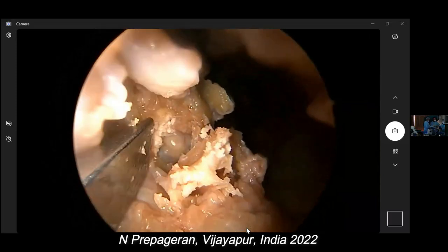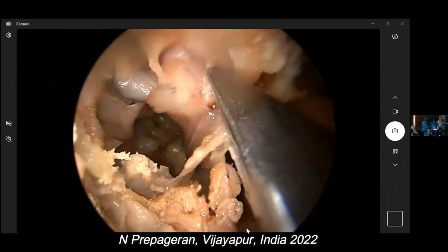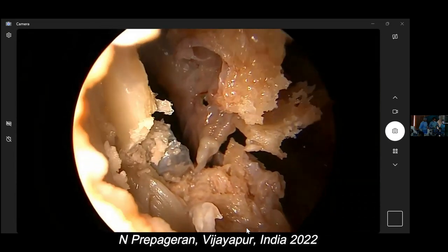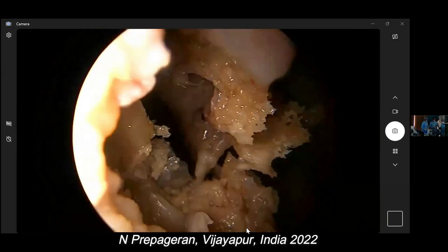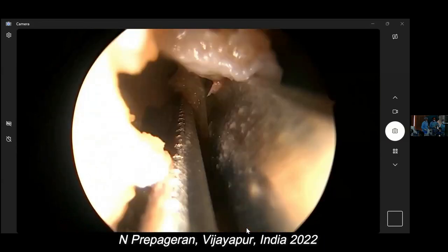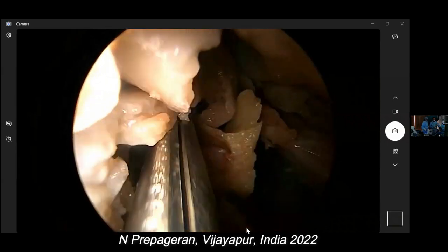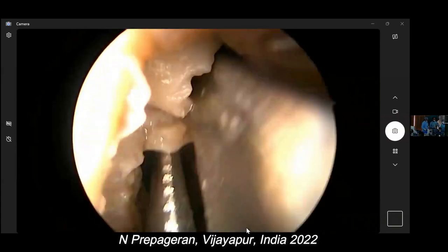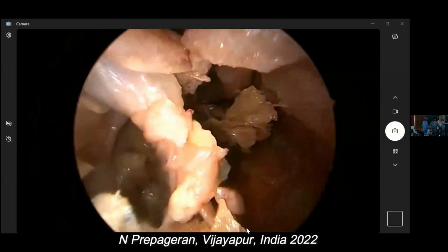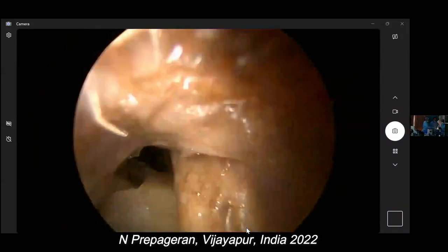There, I'm in now. Okay. There. This is now Denker's procedure. So how do we take care of this lacrimal duct during Denker's? Yeah, I'll show you. I'm just about to show you. Patience, my child, patience. But I like your question. It shows that you are an experienced surgeon who's thinking. Good.